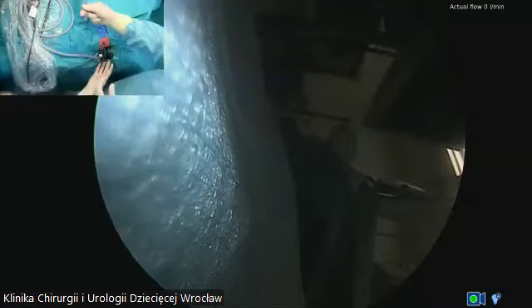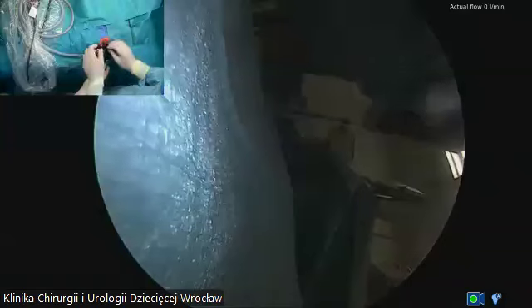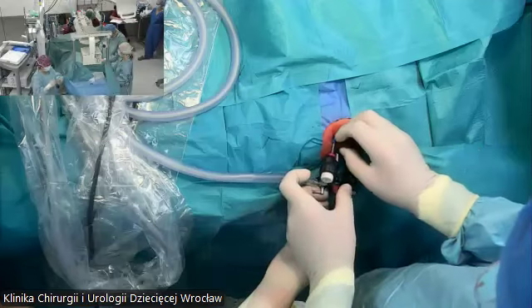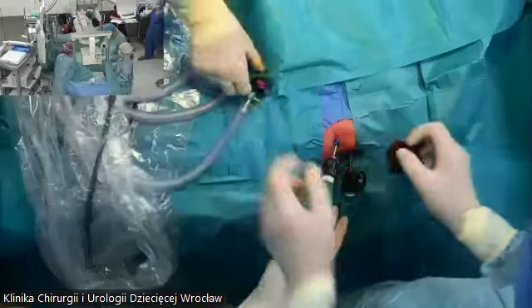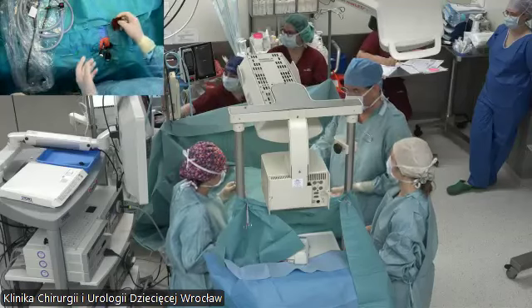Darek, why don't you use a transfixed stitch and you prefer only ligation for closing the fistula? Okay, Mario, the only limitation for me not to put a clip is that you need to use a 5mm trocar. That's the only reason, nothing more. And for me, ligation is almost the same as placing the clip.